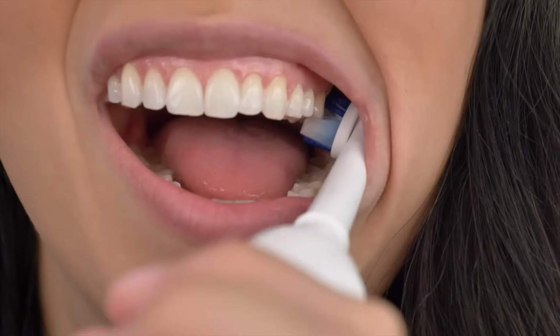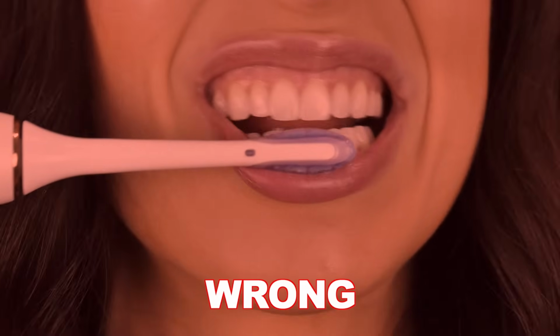And don't forget to allow the electric toothbrush to do the work for you. I know I keep saying it, but it really is important to hold the brush head in place for a few seconds before moving on to the next tooth, and always apply gentle pressure. I can't stress enough how important it is to not press super hard and scrub brush. Be gentle, the brush is doing the work for you. When people are using an electric toothbrush like a manual toothbrush, it's no good. You're on your way to hurting your gums, so please just let it do the work for you.